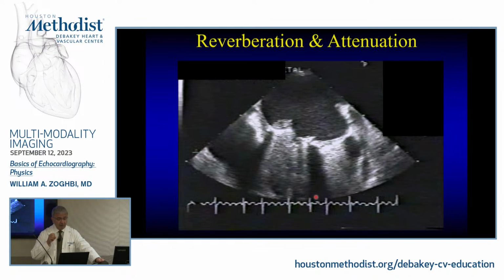So here, all these images are sent by bursts. They're called packets of ultrasound. They go in packets, and then it goes back, gets reflected. I record it on my same emitter. The same emitter is the receiver, okay? And therefore, I could do that.